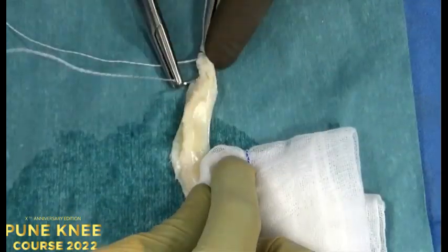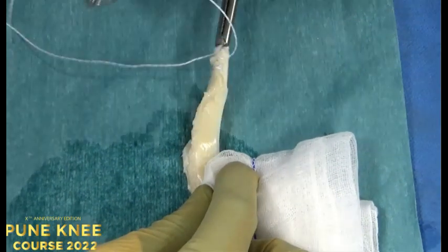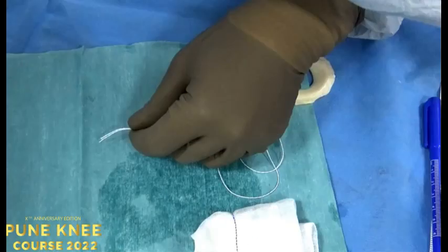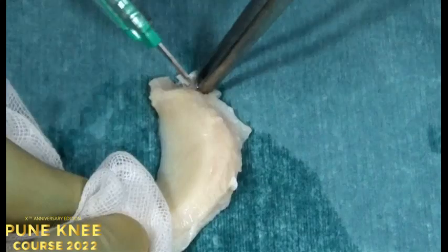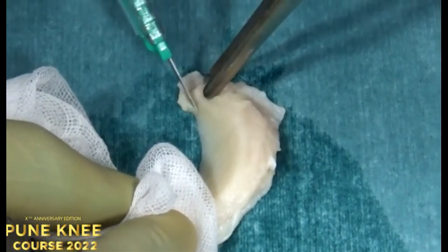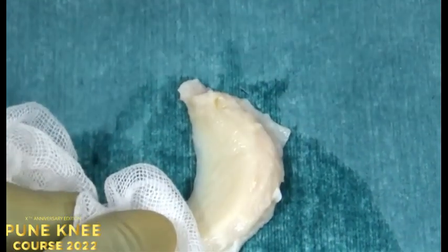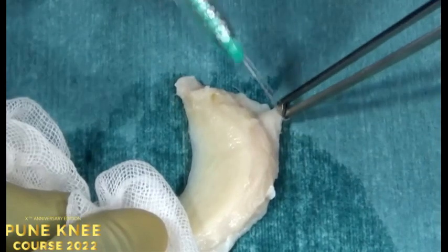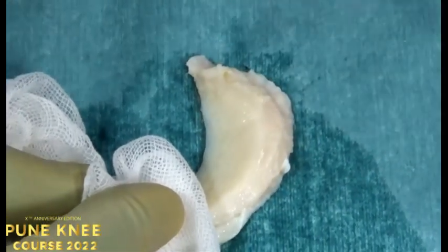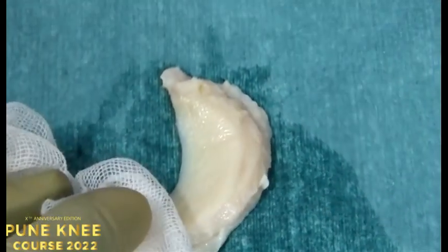You're seeing there the whip stitching, similar to what we do to any tendon, semitendinosus or ACL or whatever. Another question, Pablo: normally you need to thaw that graft before you start using it. Do you use simple normal saline or do you use it with vancomycin? I always use it with vancomycin, yes. It's 1 gram of vancomycin in 100 milliliters of normal saline.